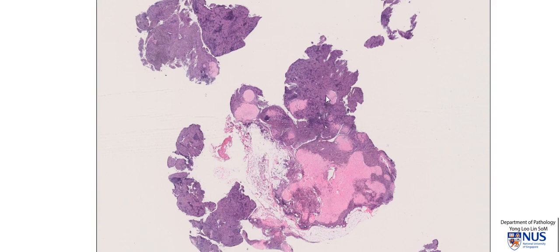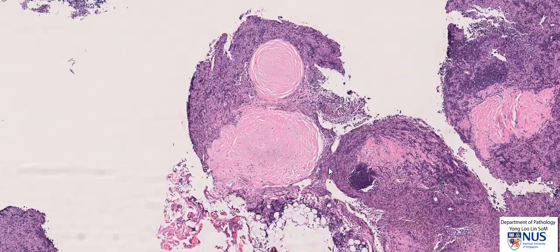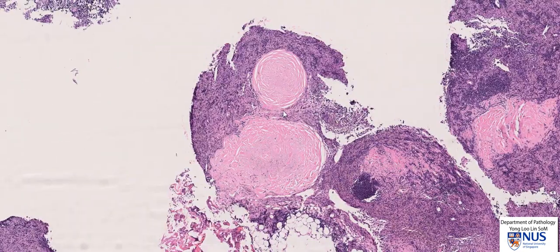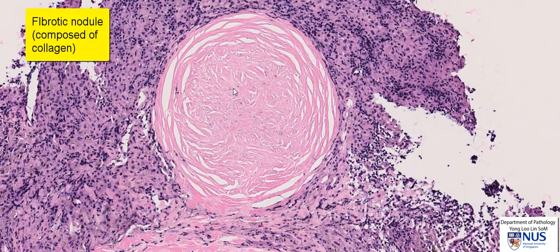The abnormal areas are these pale pinkish areas which can be rounded or somewhat more irregular. Let's zoom in on these abnormal areas. Over here I can see that there is this rounded, kind of like a fibrotic nodule. This pink material is collagen.